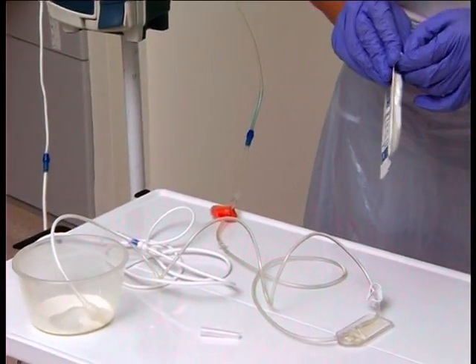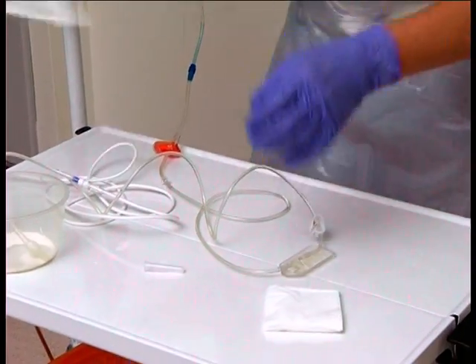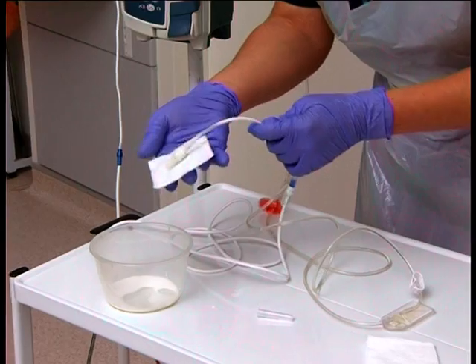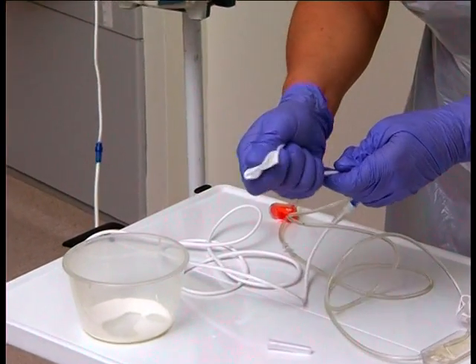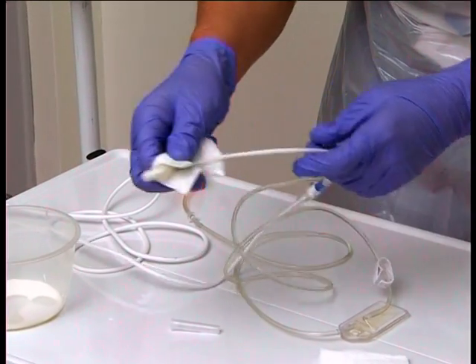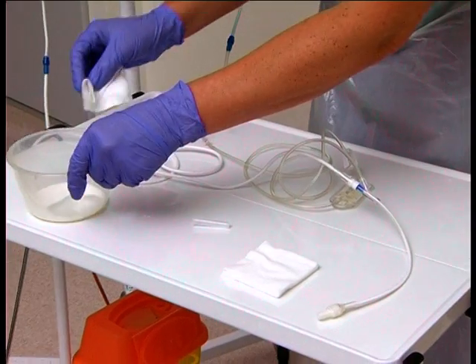Open a pack of sterile gauze and place it on top of the trolley. Remove the end of the giving set from the bowl and use 1 or 2 pieces of the gauze to dry the end of the giving set. Put the dry giving set end on the trolley surface, remove the bowl and clean up any spillage.